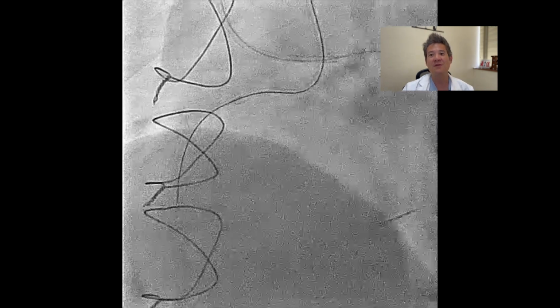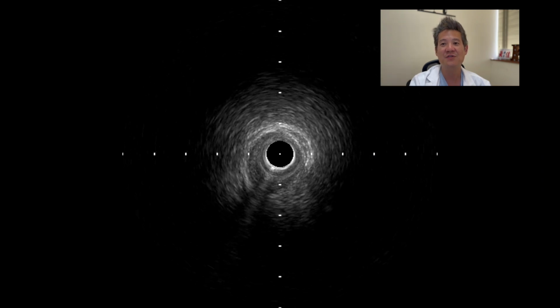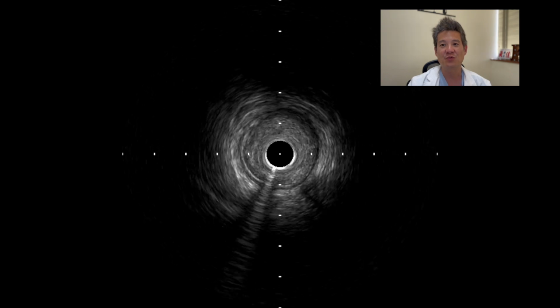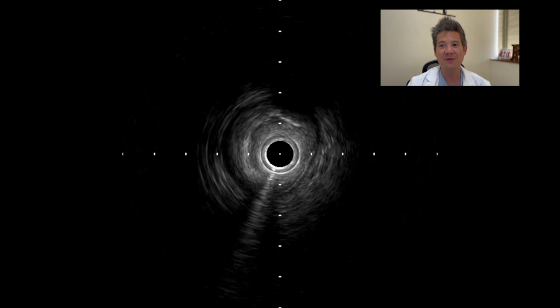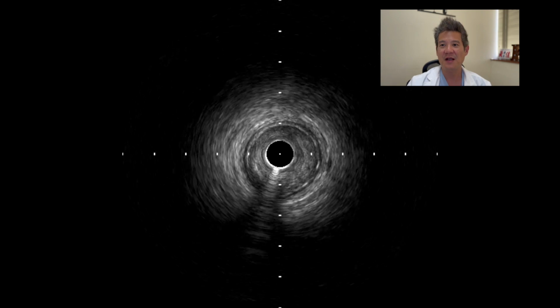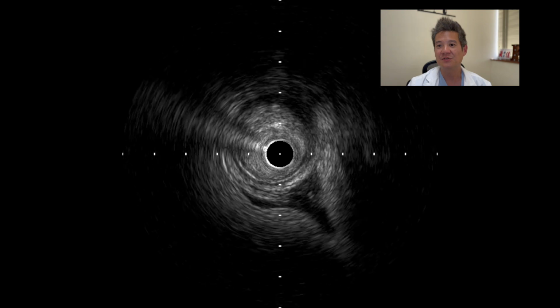And with the wire in the antegrade PLV, I moved back the Turnpike Spiral catheter, and then I ballooned the lesion, and then I put in an IVUS, and you can see the IVUS in the distal part is all in true lumen. And as we move towards the proximal part, the IVUS goes into the subintimal space for a very short segment before coming back into true lumen in the ostium. So I'll let the IVUS play through, and you can see here the IVUS is in the true lumen, and the mid-RCA is still in the true lumen.